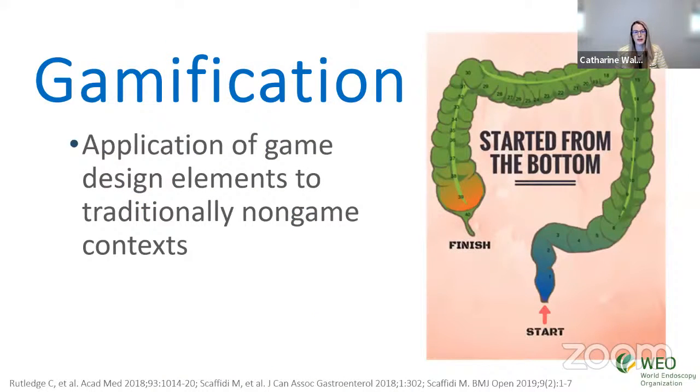And the final innovative and potentially applicable educational strategy for endoscopy is around gamification. So this is where you apply game design elements, things like leaderboards or points, to traditionally non-game contexts, such as the simulation-based context. And we're currently in the midst of finalizing a study looking at the integration of gamification into endoscopy simulation-based training.